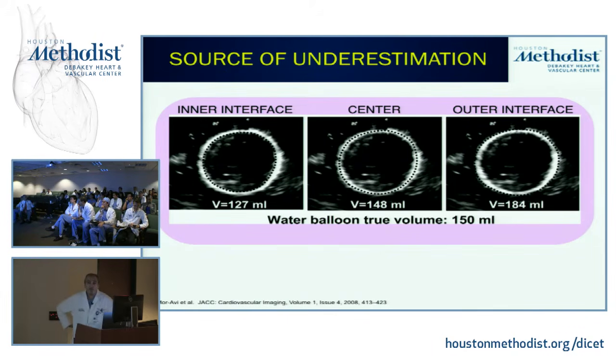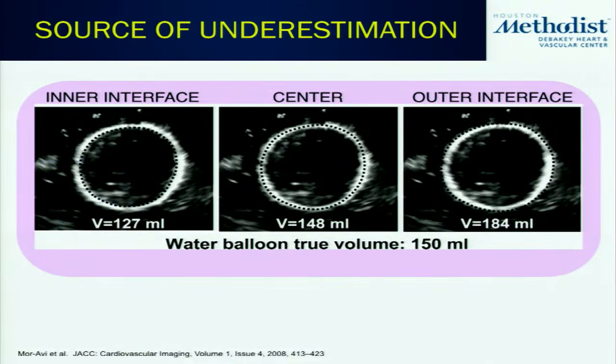This is how you're going to tie what you learned last week, I guess, what was it, echo, right? And lateral resolution to this. So this is a balloon. I don't know what kind of material the balloon was from, rubber or whatever it is. But remember that the lateral resolution issue of ultrasound is a big thing. So if I have a phantom with a pin, just a pin, okay? In the lateral resolution portion, a pin would look like this guy. It has lateral issue, right?